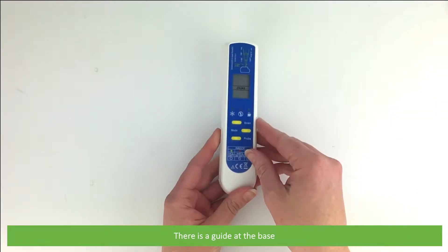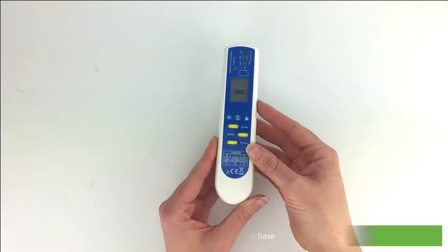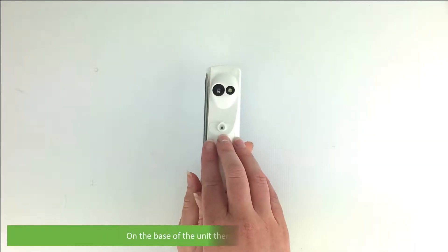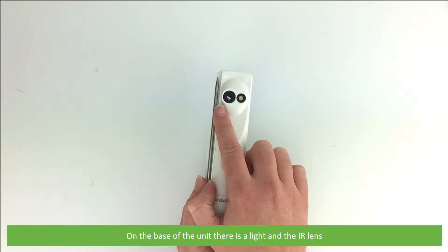There is a guide at the base. On the base of the unit there is a light plus the IR lens.